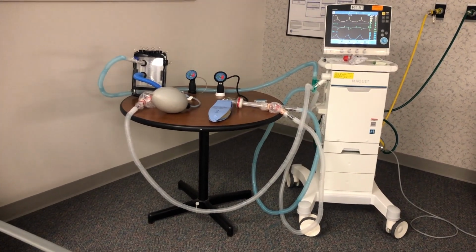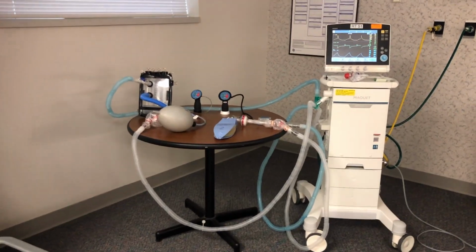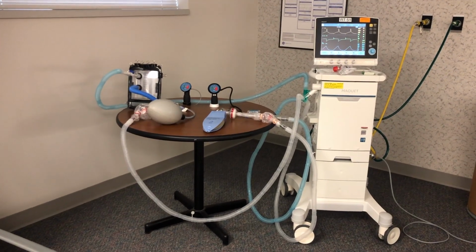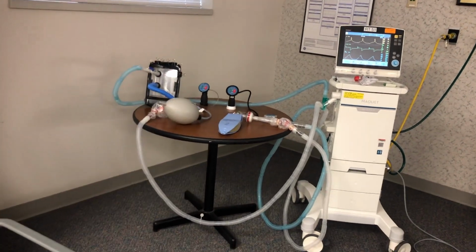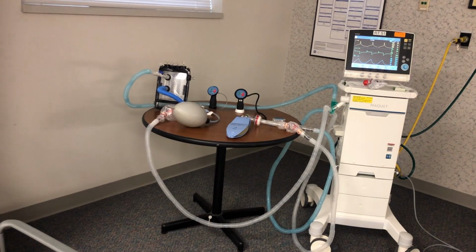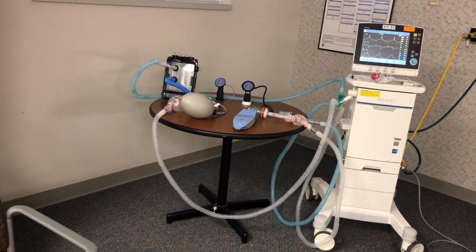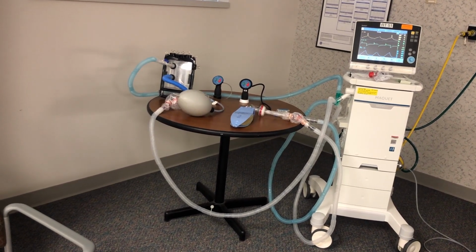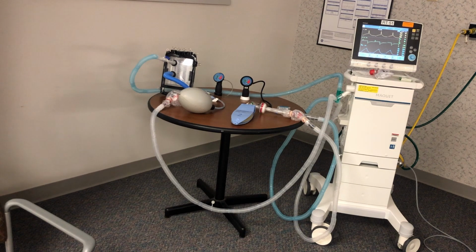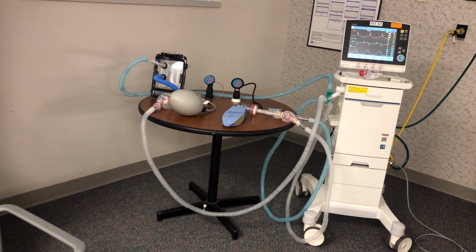Again, the alarms should be on the patient monitor for oxygen and not on the ventilator, and also you can put an alarm for respiration there to check for apnea. So on a patient monitor, if we set an alarm for, let's say, respiratory rate less than 6 or oxygenation less than 89%, we should be able to almost mimic the apnea alarm on the ventilator.